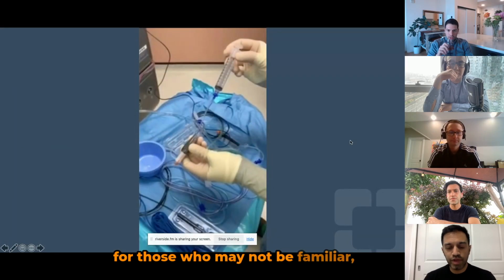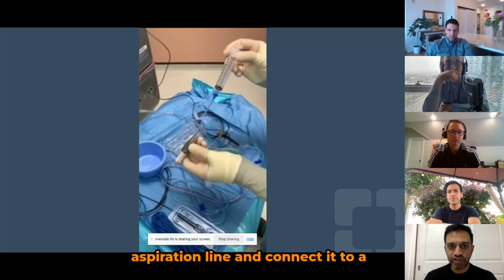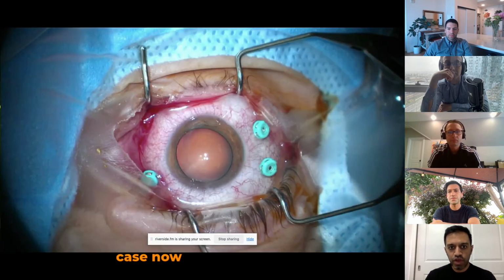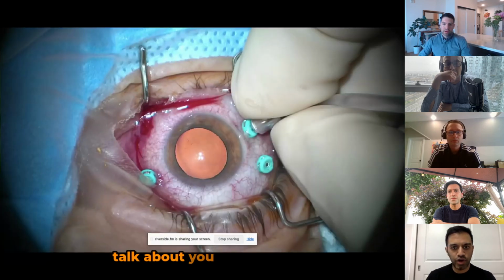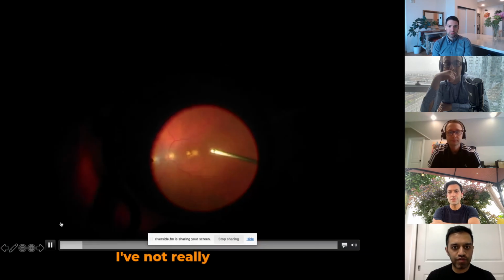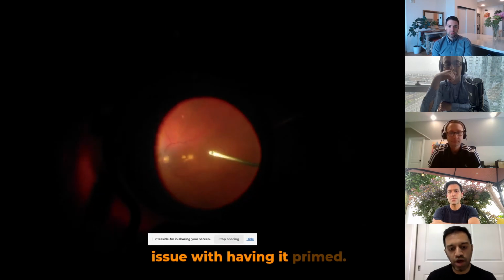So for those who may not be familiar, you disengage the aspiration line and connect it to a syringe. I typically just use a 6 cc syringe. So here we're starting the case. Now, one thing that is somewhat controversial is whether or not to prime the infusion line. I just go ahead and prime it. I've not really found that there's a real issue with having it primed.